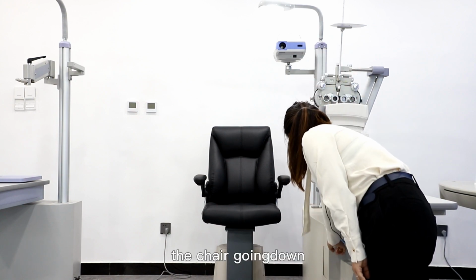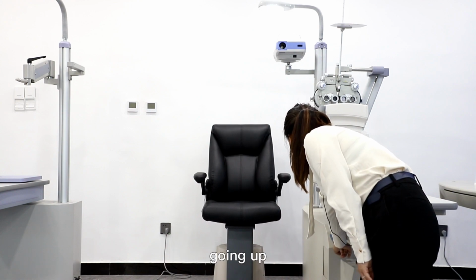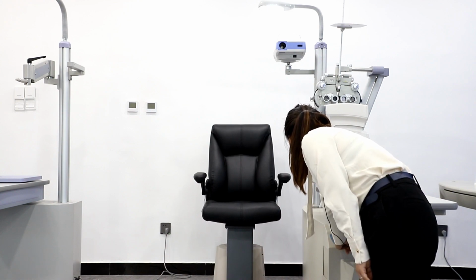The chair is going down, going up. And it also can go down.